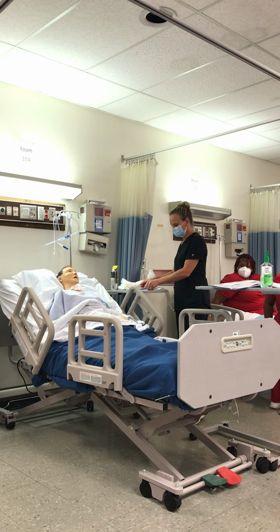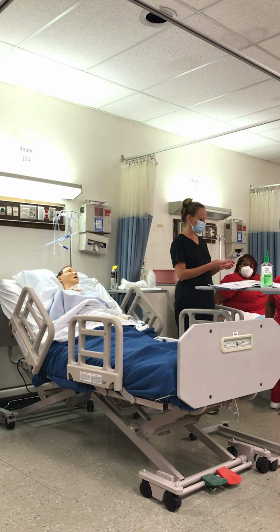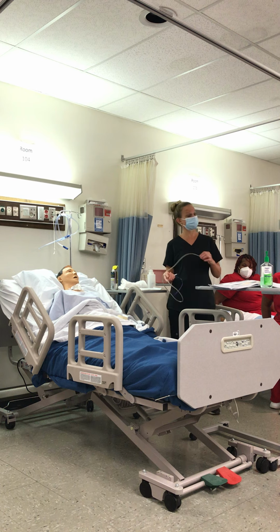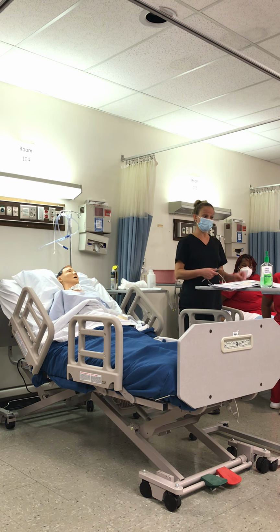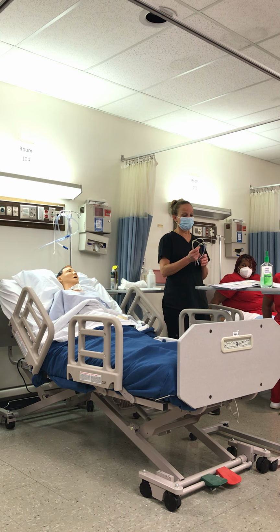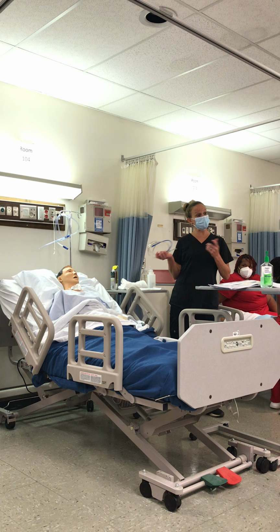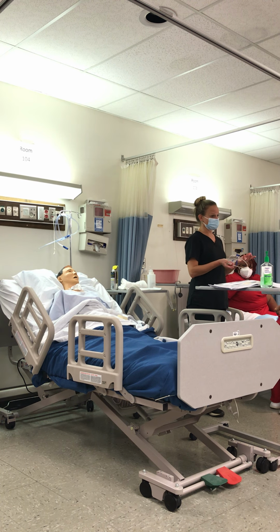Because this is going to go in that body, we don't want to be touching it if our hands are not clean, okay? This one's pretty... So it's not sterile? No ma'am. So we don't need gloves. You need gloves. You don't have gloves on. But I'm not at the point yet where it would be okay to put gloves on to do this.